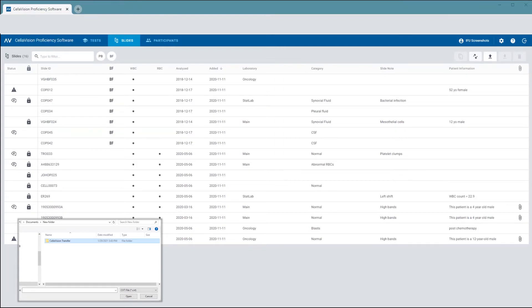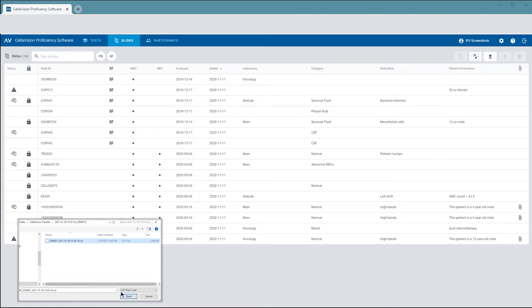If you used a USB flash drive, insert it into the computer and choose it as the file location. Select the slides you want to upload and click Open.